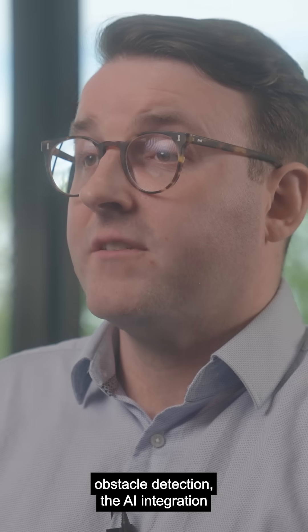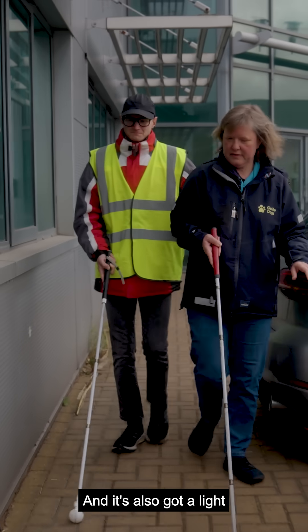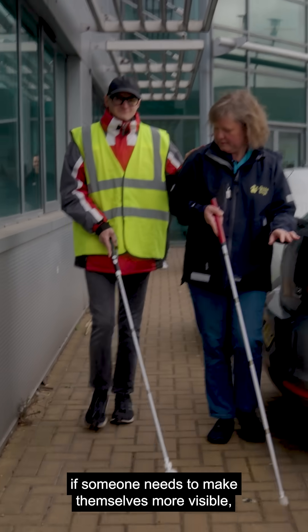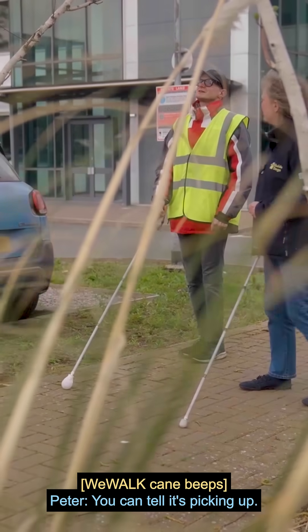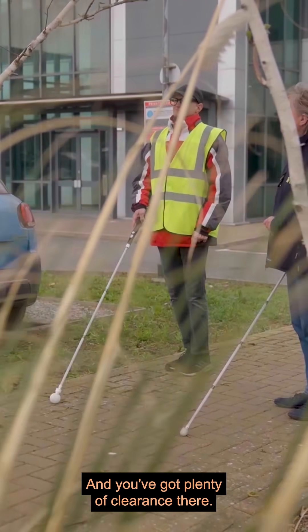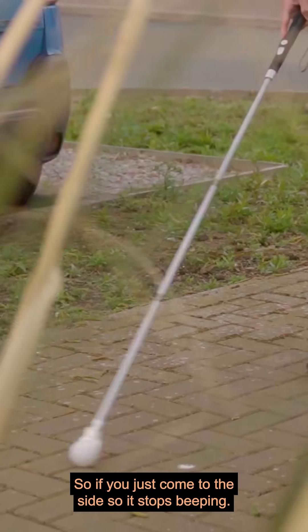There's also AI integration, so you can chat to the AI chatbot through it, and it's also got a light for when someone needs to make themselves more visible crossing a road. You can tell it's picking up — and you've got plenty of clearance there, so just come to the side so it stops beeping.